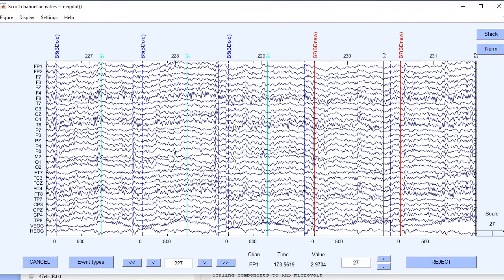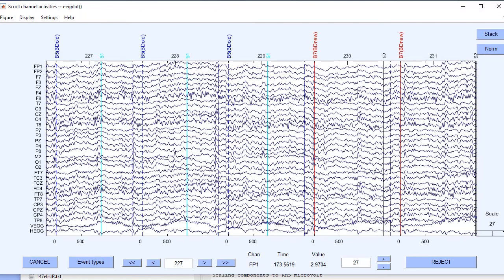Okay, this is some sample data and I've already done a lot of processing on the data. So it's been down sampled to 256 hertz. It's been filtered and it's been epoched, meaning we pull out the individual trials.